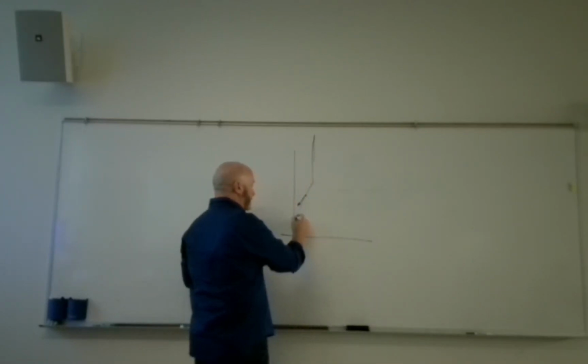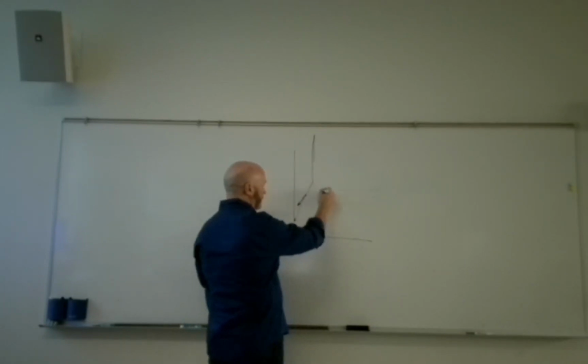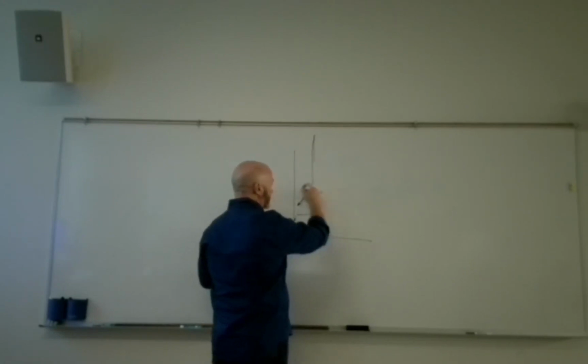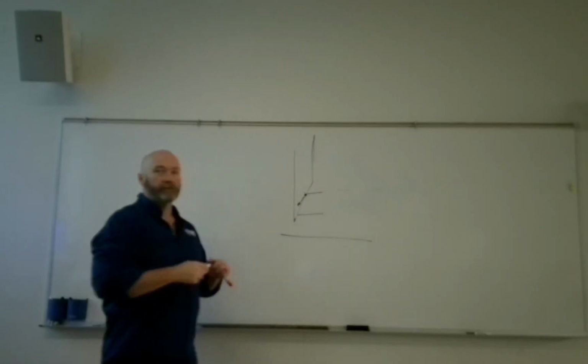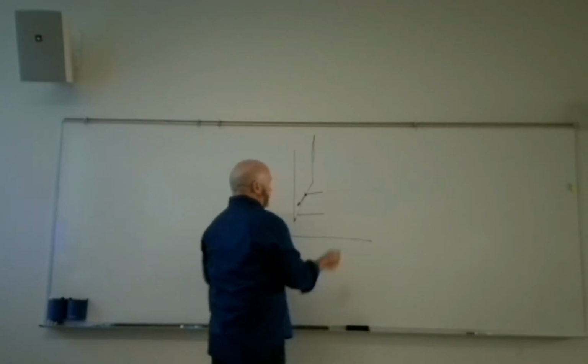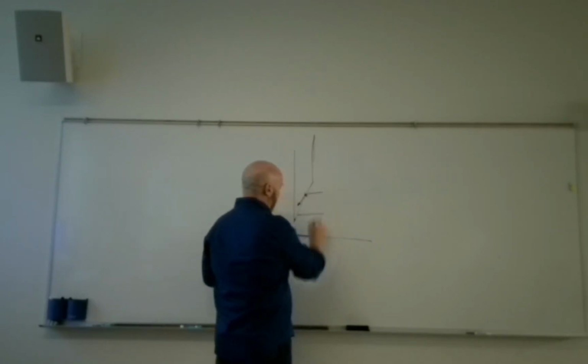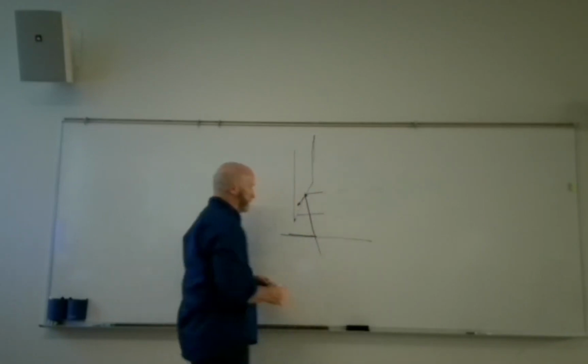So since we're coming off at an angle, right? We're coming off our anode at a bit of an angle. What I'm going to do is create X-rays here. They're going to go off with equal intensity in all directions. We have a word for that. That is isotropic emissions, right? So we're going to have X-rays that are created here, and they're going to exit the window. We're going to put the window right there. They're going to come through the window right there. Okay?